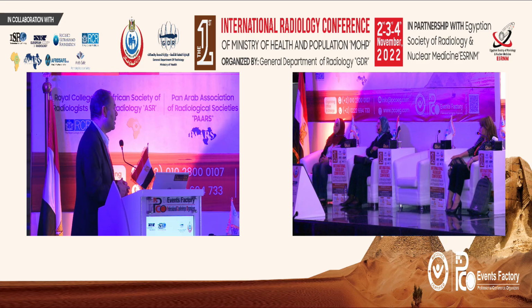But the follow-through study is still there, especially in the ER setting, for patients with bowel obstruction who they want to treat conservatively without surgical intervention. They put in an NG tube and usually give water-soluble contrast, not barium. We hardly use barium now, especially in obstruction cases.